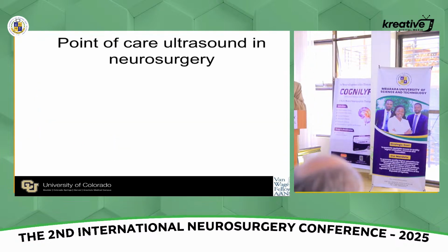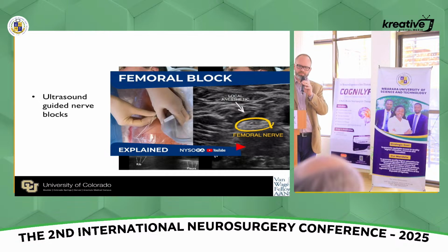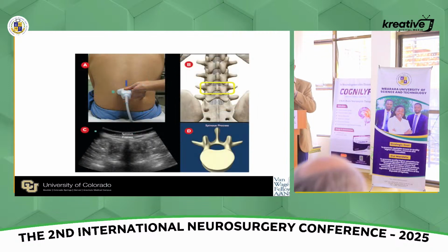If we think of point-of-care ultrasound in the ICU, we can do ultrasound-guided procedures for central lines, IVs, femoral blocks, and other paraspinal blocks. Ultrasound can be used to guide lumbar puncture in settings where a patient is difficult to get into the intrathecal compartment.